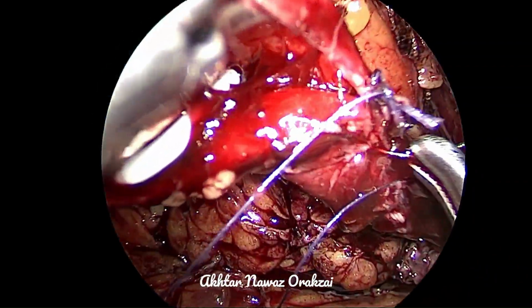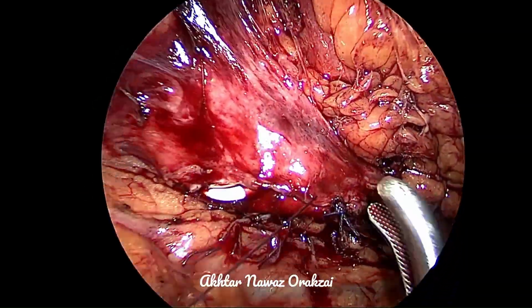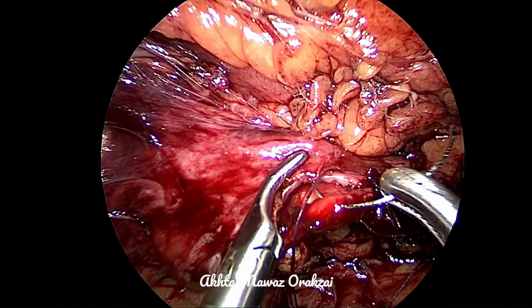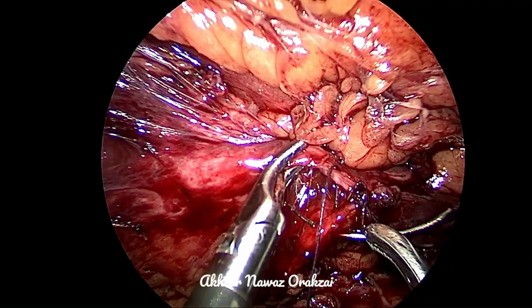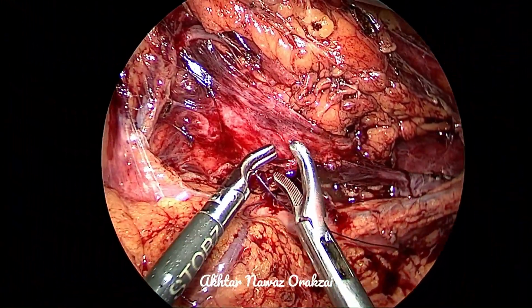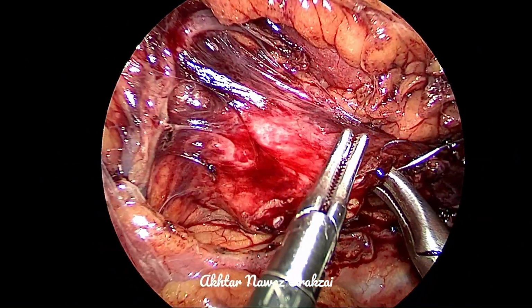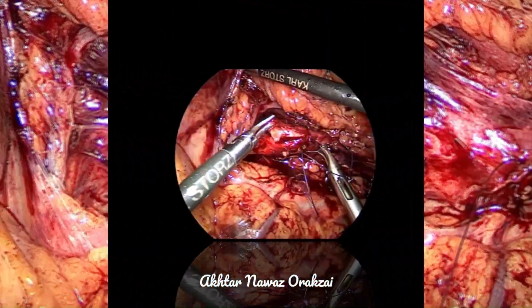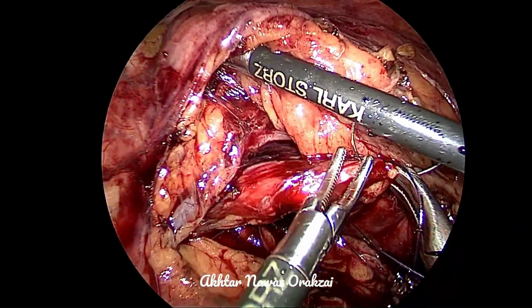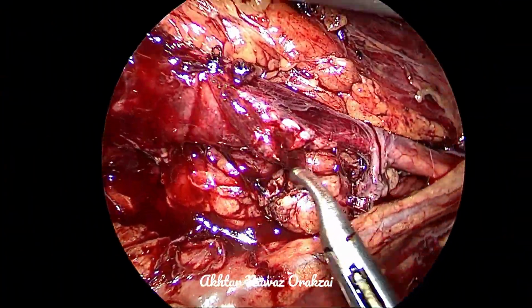You can see that the anastomosis is looking quite nice. The suture line is watertight. The shape of the pelvis is quite funneled. It is a dependent anastomosis. The lower edge of the anastomosis is not under tension. It has very easily reached the ureter. Care must be taken at this level not to take the DJ stent in the stitch, because that will be a big problem which will become evident.